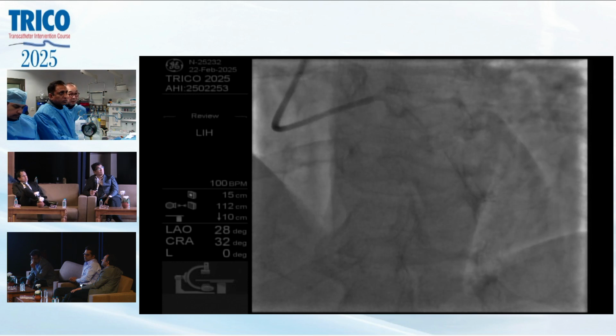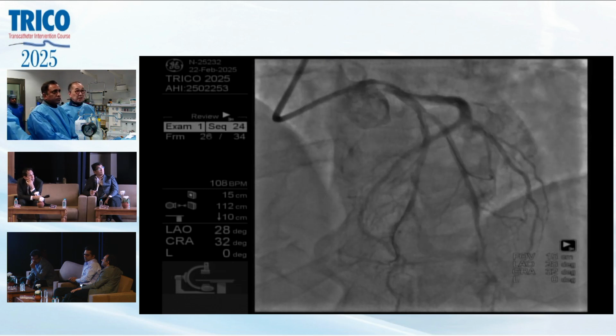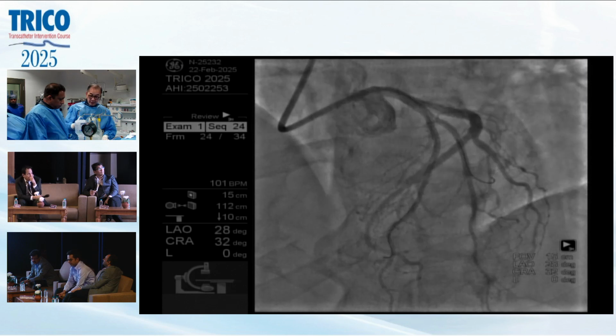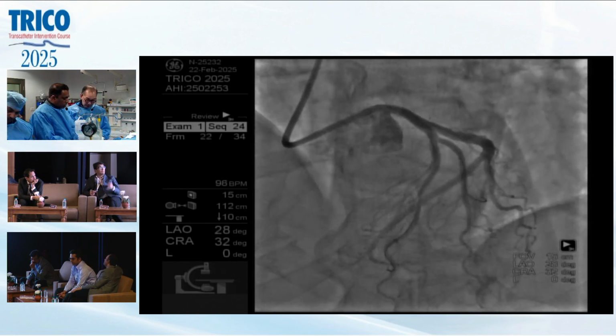Okay, ready? Okay, this is after nitro. I think it's not that bad. Okay, let's do an OCT for the LAD. This is LAD, right? This one, yeah.